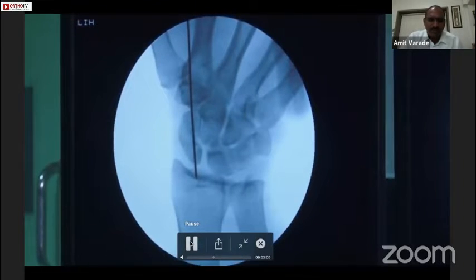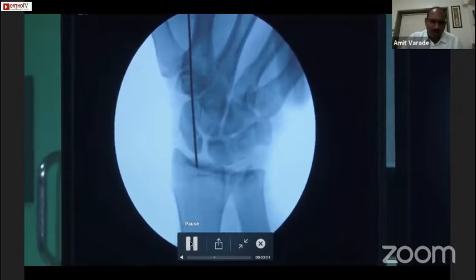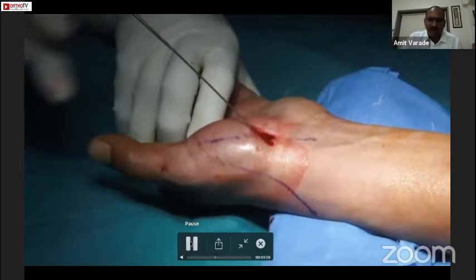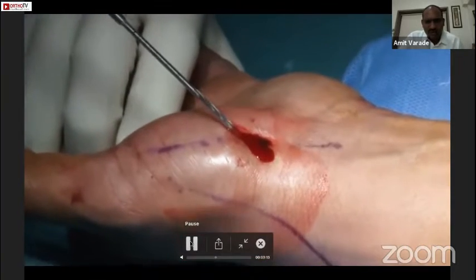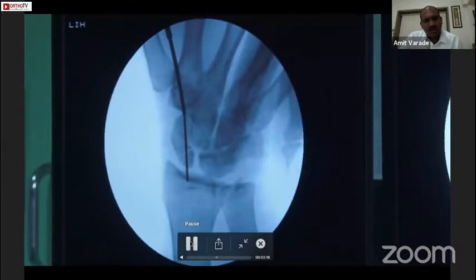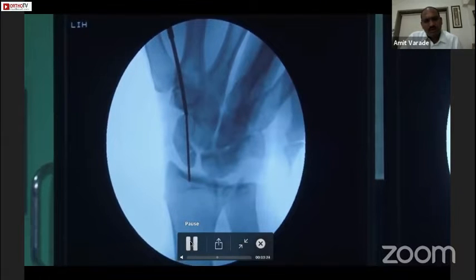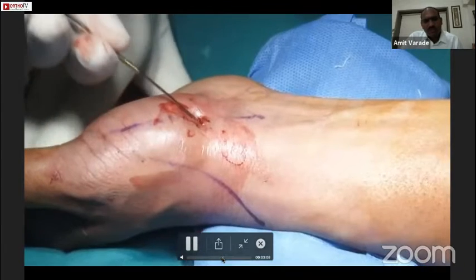I generally put a guide wire into the distal radius after measuring the screw length, because a lot of times while drilling the wire can come out, and it is very difficult to put the wire back into the same hole. Now this is the 2 mm drill bit — we have to drill slowly.